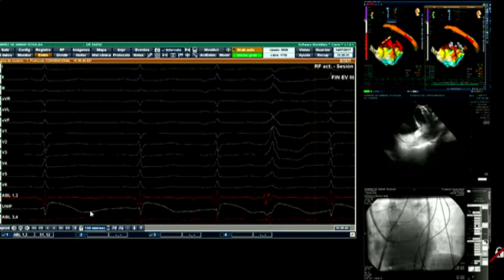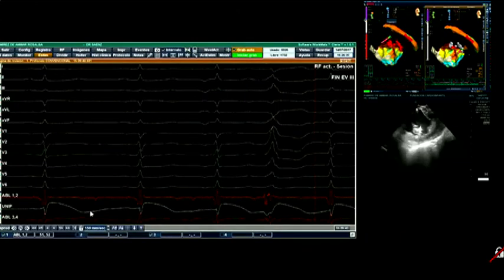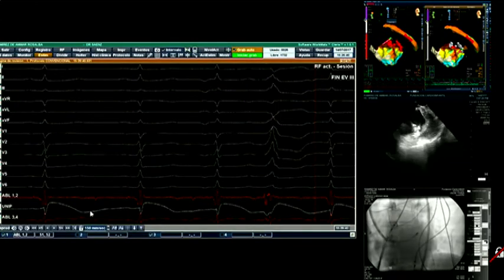We didn't go up to 35 because there was a reduction in extrasystoles. And in this place, we eliminated the extrasystoles. We had been waiting for 30 minutes and they haven't come back. And this was the case based on what we activated.